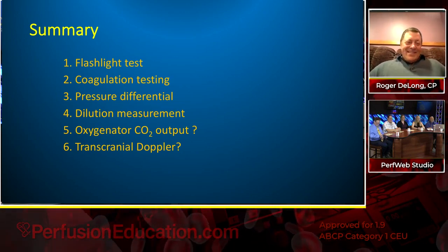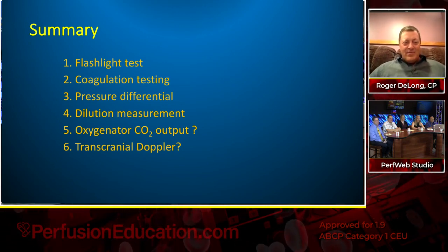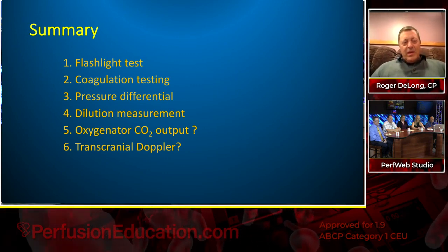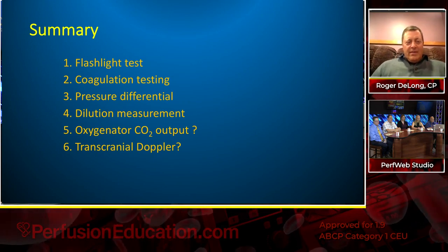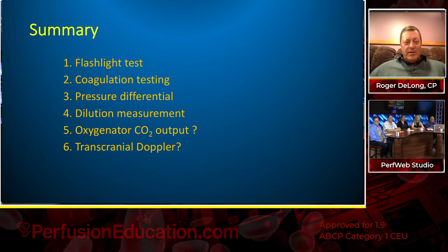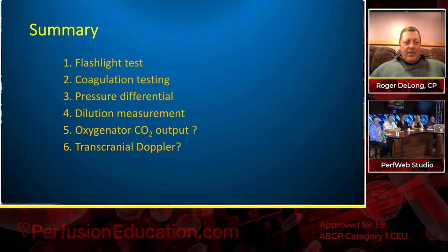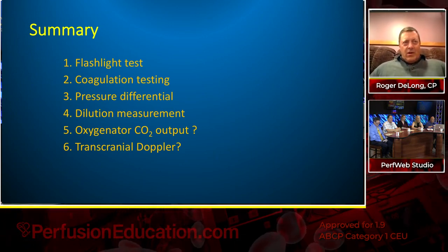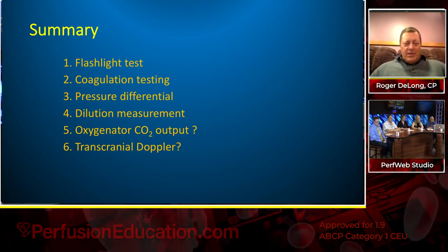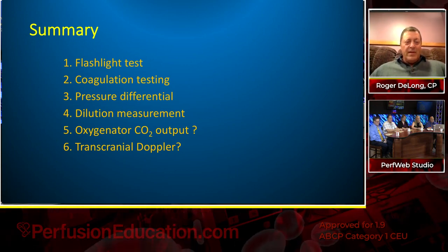Oh, no. All right. Well, to summarize, we already talked about the flashlight test and how much fun that is, and coagulation testing, which will continue, neither of which are very quantitative. The pressure differential, I'm sure, will continue to be used and trusted by most people, but it's horribly misleading. I would advise anybody doing this to start cutting the oxygenator out of the circuit before they trash it and rinse it out. I think you'd be pretty surprised at the variability of patterns. It's incredible when you first see the first view.